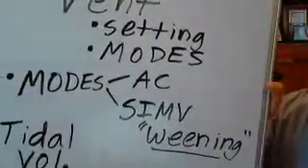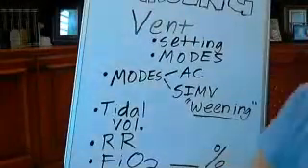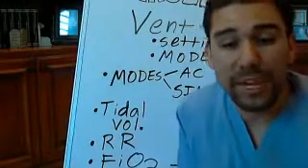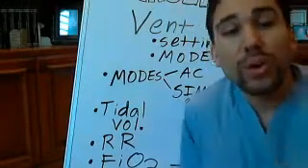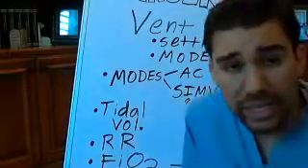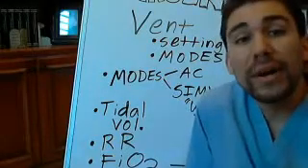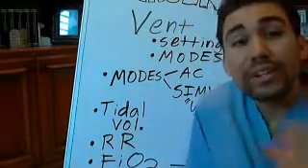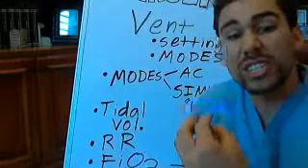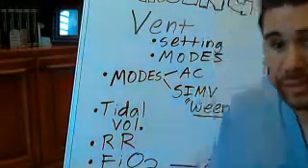This AC mode is breathing for your patient. So your AC mode is full-fledged breathing for your patient, pushing oxygen, pushing air down into those respiratory tracts.